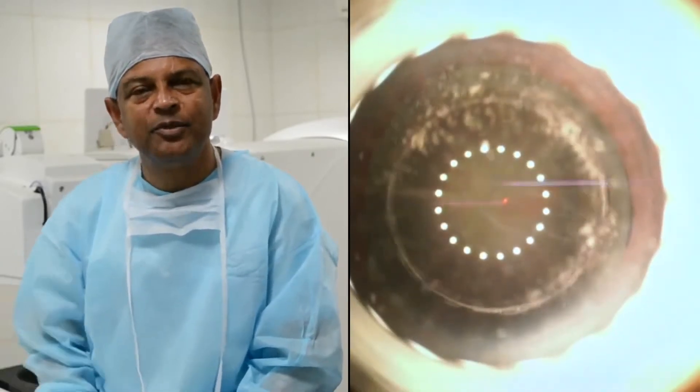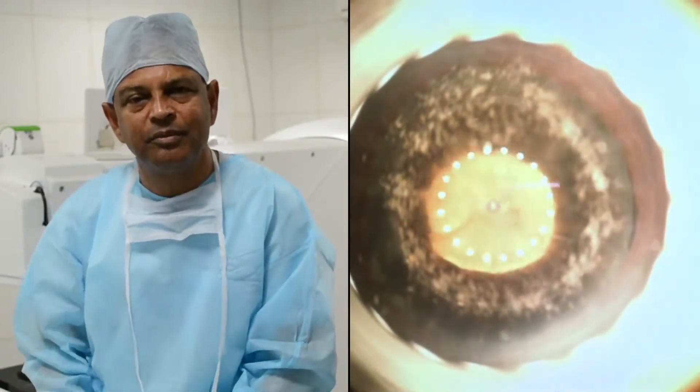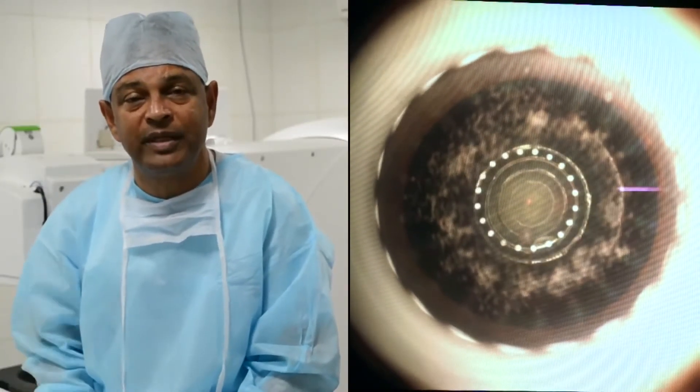Then I moved on to doing a cross — the profile I used to make four quadrants. This is the fragmentation. I went by that style because every one of us are used to chopping techniques, so I followed that initially.